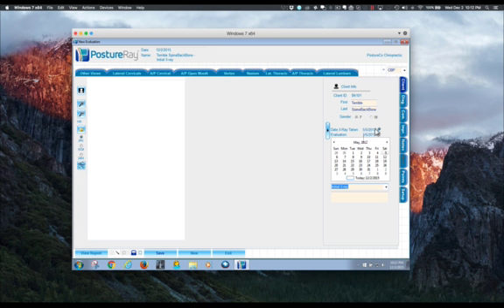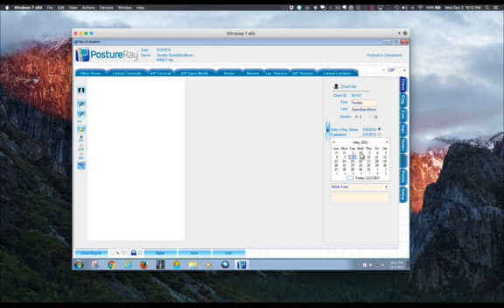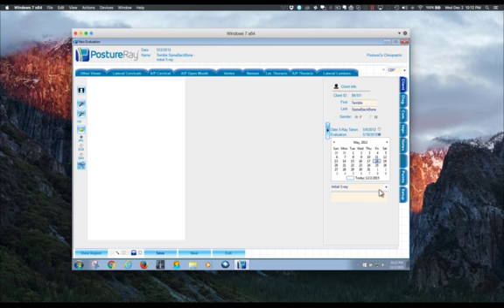So all you do is put the little cursor dot where you want it. So we're going to change this x-ray date to, we're going to make it the 8th and the evaluation we're going to say was done on the 18th, so like there were outside films.